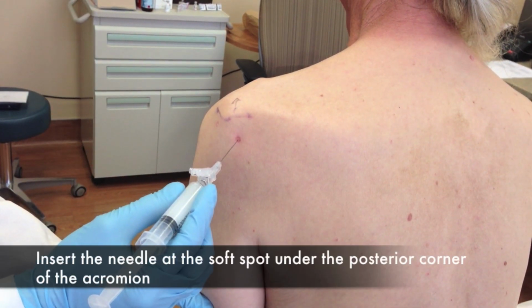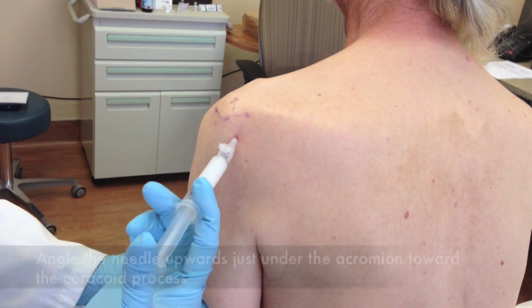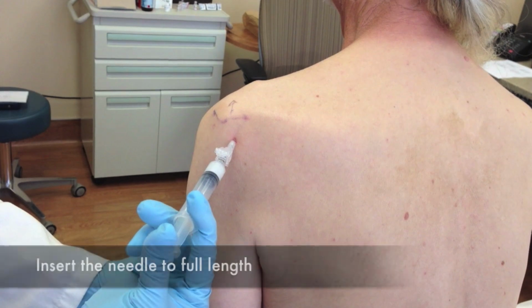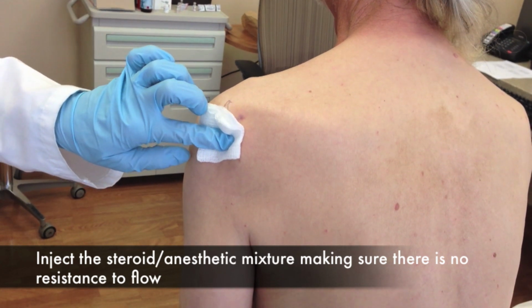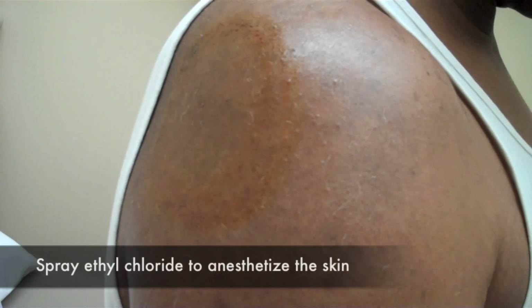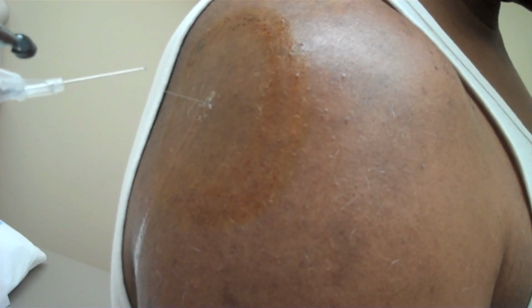Insert the 22 or 25 gauge needle quickly through the skin and angle the needle slightly upwards under the acromion towards the coracoid process. Insert the needle to full length. Inject the steroid mixture as long as there is no resistance to flow. Remove the needle and apply pressure with a gauze until any bleeding has stopped. Then apply a Band-Aid.